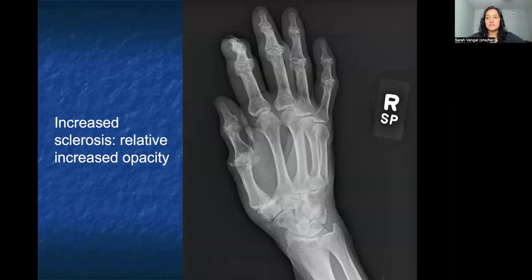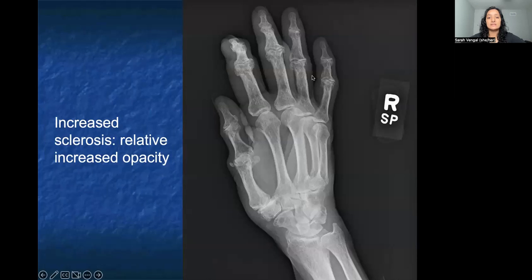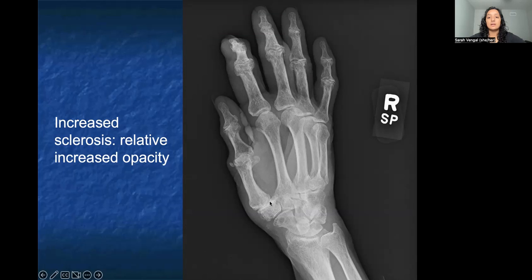One of the more common things we discuss in sports medicine or ortho is whether or not we see increased sclerosis, which is a relative increase in opacity. When we look at this individual's right-hand x-ray at the DIP of the first digit, you can see there's a brighter white along that joint — same thing along the PIP and along the first CMC joint. This increased sclerosis is indicative of osteoarthritis, where the body is laying down extra calcium to compensate.